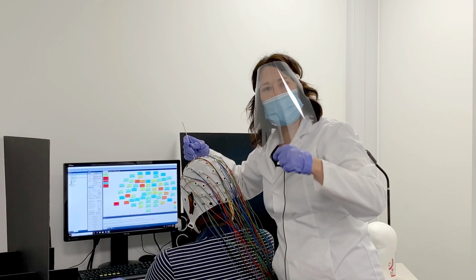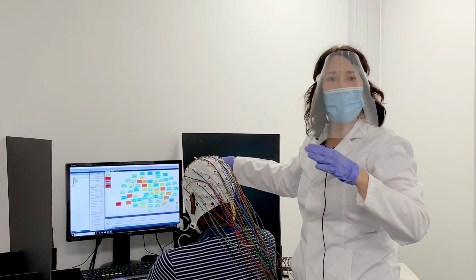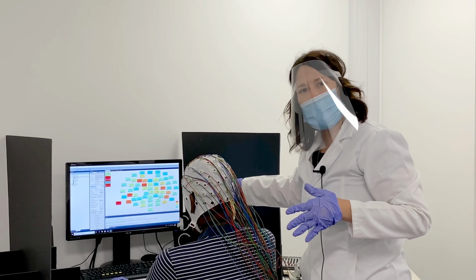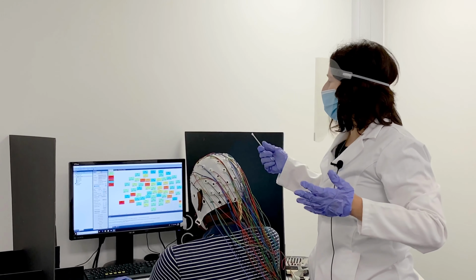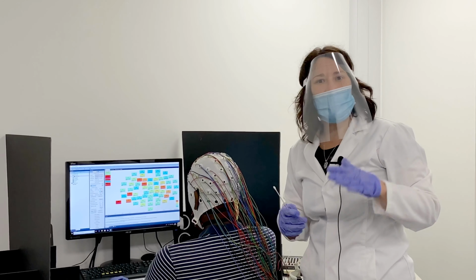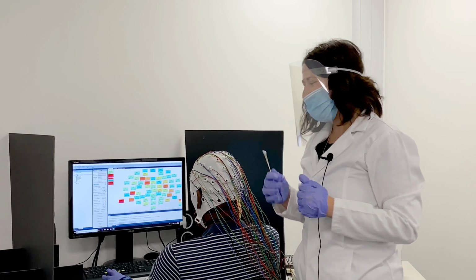The impedance gets low. On the screen it will turn first orange, then it goes to greenish, and in the end to blue, and this is where we want the electrode to be. Because the impedance is very low, we get a clear signal and we can start the recording.